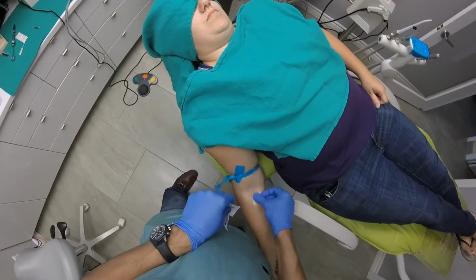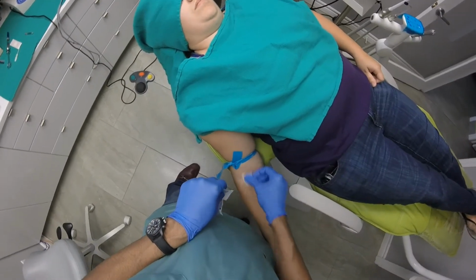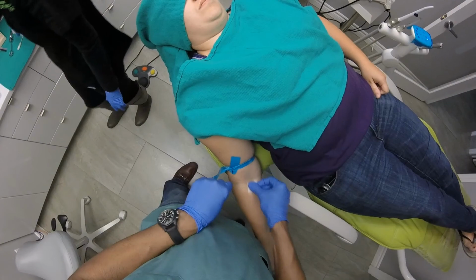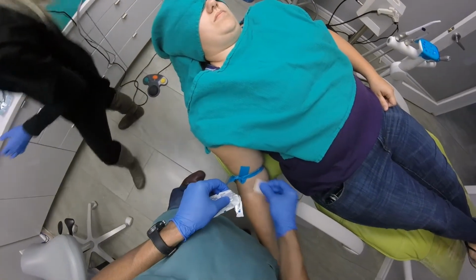Normally in these sorts of circumstances, as you'll see inside the video, I usually grab the tourniquet, the vacutainers, the alcohol, and the needle and vacutainer holder apparatus. My assistant will normally hand me the other stuff that I require.